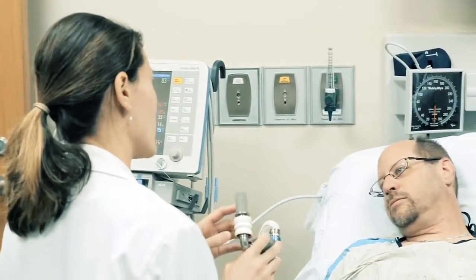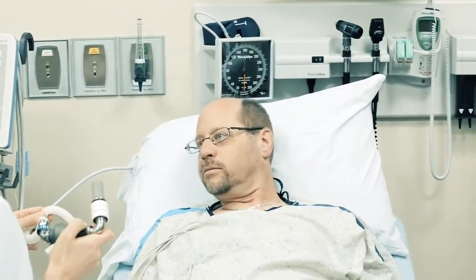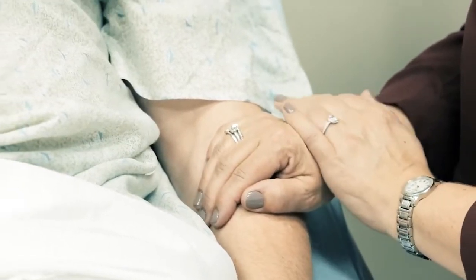A VAD will not cure heart failure, but it can help relieve your physical symptoms like shortness of breath and fatigue. The decision to get a VAD is not an easy one. While the VAD may be able to extend your life, it requires a complex open heart surgery, commitment to complex aftercare, and your adjustment to a new normal.